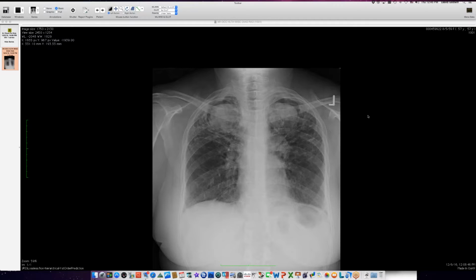Okay, so this was a B reading that was sent to me this week. I decided this was abnormal and called the group that coordinates this B reading program around the country, and was told that the woman has stated on her physical exam that she has an abnormal chest X-ray. So she and I were in agreement. She does indeed have an abnormal chest X-ray, but this very symmetrical upper lung scarring and cavitation, and then something in both cavities. Tom Mohammed has sent me cases like this from Cleveland before, but this is the first time I've ever seen one here. And I think this lady was from Eastern Washington.